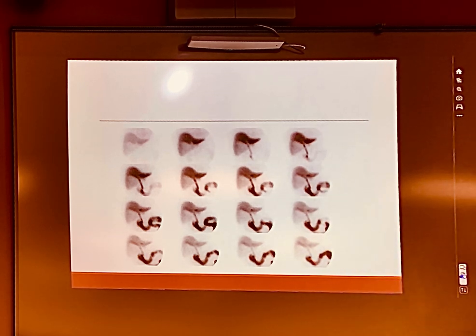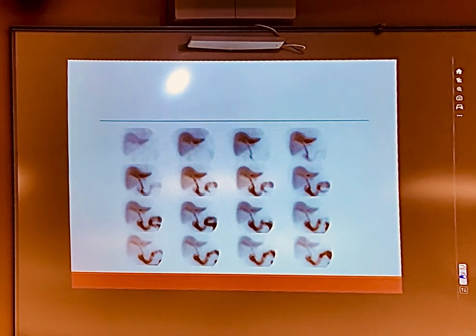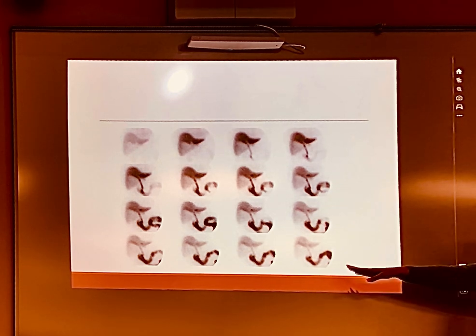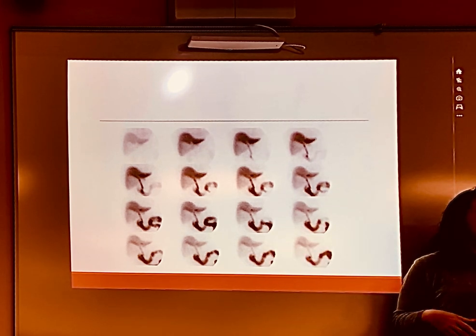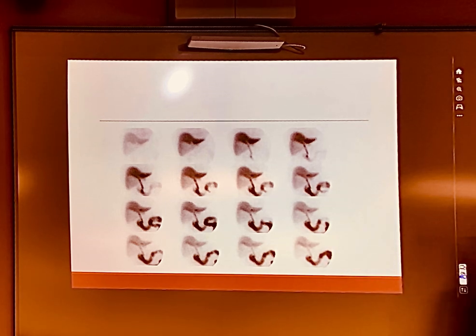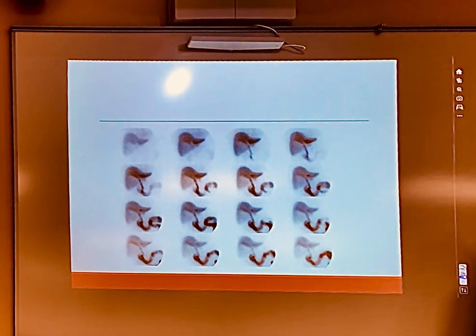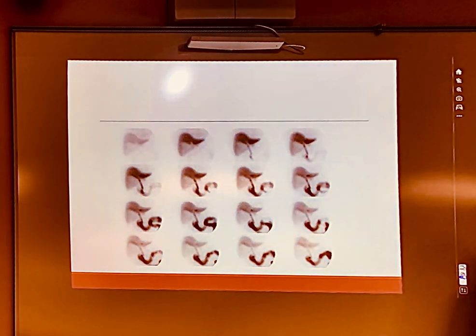So it really just depends on the radiologist, and that's one of those calls where you take them the picture and you go, what do you want us to do with this? Some radiologists will look at this and say, you're almost out of liver, the patient's done. Some will say, I want a 2 hour to confirm. This is when you lean on your radiologist to be like, what do you want me to do with this?